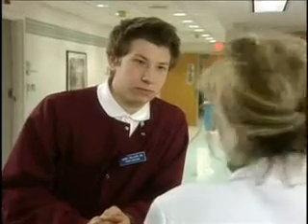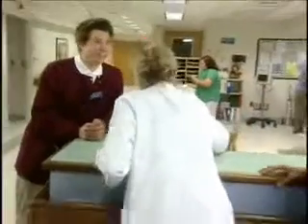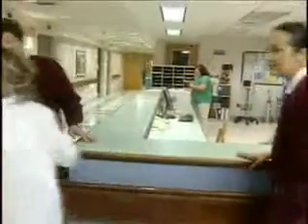I'm just going to get the transport stretcher, a bath blanket, and a regular blanket. Excellent. Remember to be very careful when moving the patient from the stretcher to the bed or the bed to the stretcher to prevent injury to the patient or the staff. Okay. We have Anna. Let's take Anna and go move your patient. All right. Down here? Yep. All right.